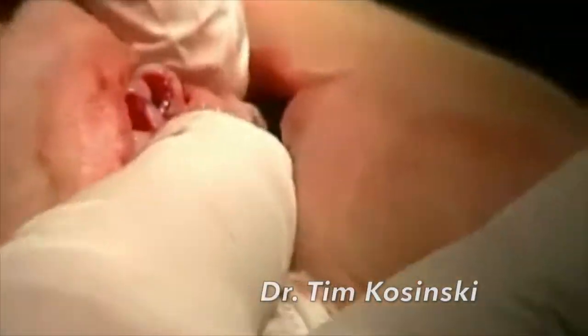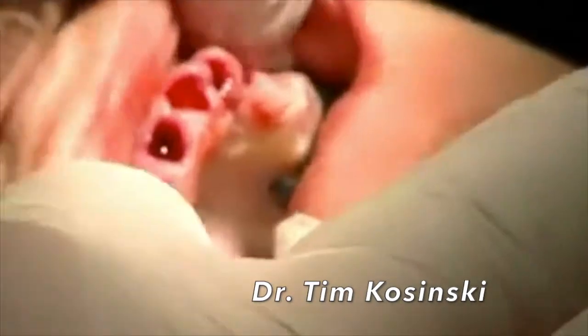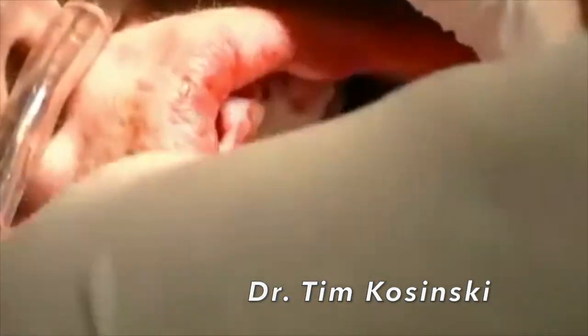At this point, the buccal plates are intact, and we're going to take our radiographs to make sure that everything is good, and then we'll go and remove the bottom teeth.